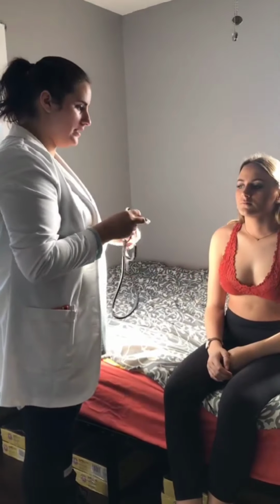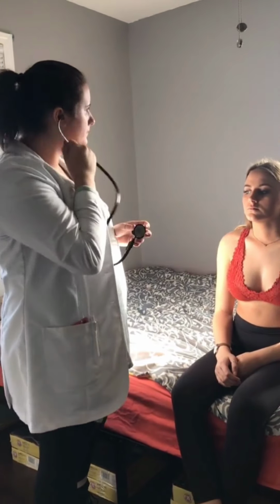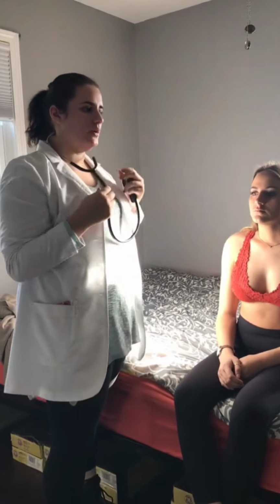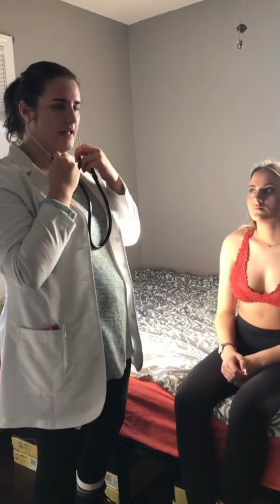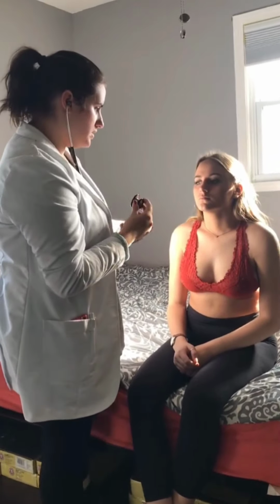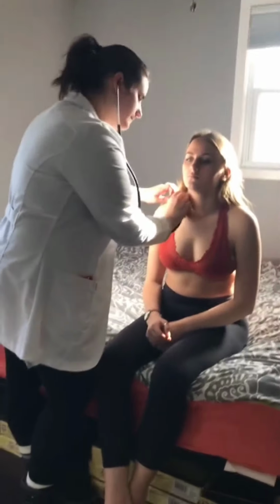So we're gonna go ahead and auscultate. We're gonna use our diaphragm, and we're gonna make sure that there's no adventitious breath sounds, that they're all clear. And we're gonna listen in the same spot. So we're gonna start above the clavicle and work our way down. When I place my stethoscope on your skin, I just want you to go ahead and take a deep breath each time, okay?